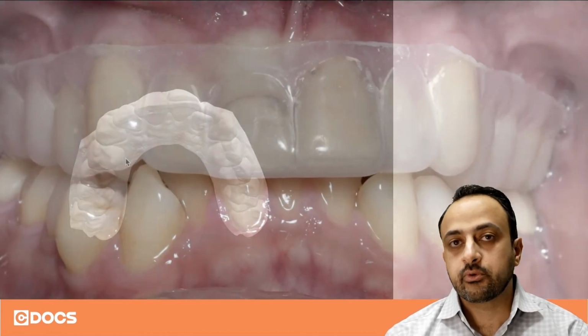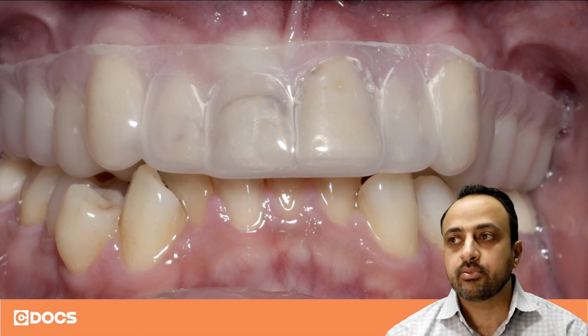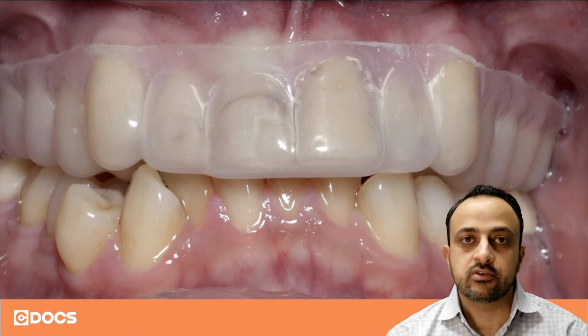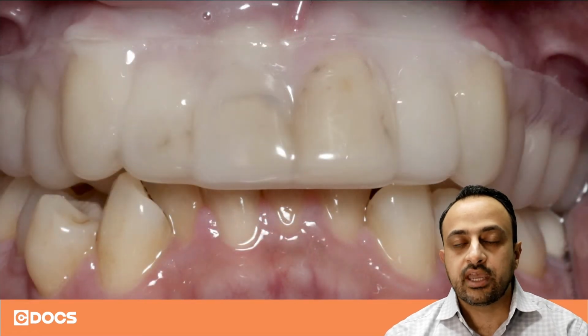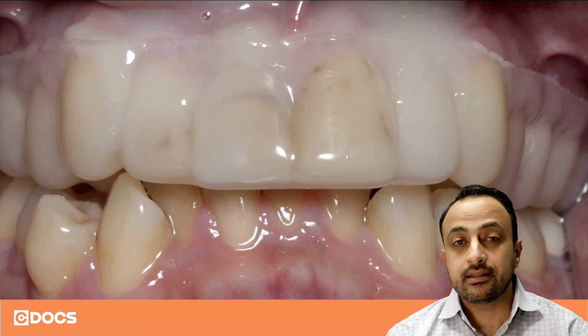So what I did is I 3D printed this model. I created a Copyplast matrix, as you can see here on the screen, using my Mini-Star pressure former. I then loaded that with any bisacryl material you have in the office. In this case, it was Integrity. I loaded it with Integrity and then seated it in the patient's mouth.